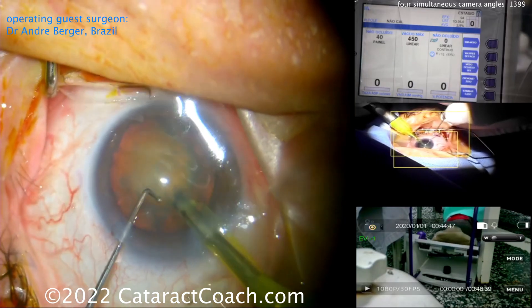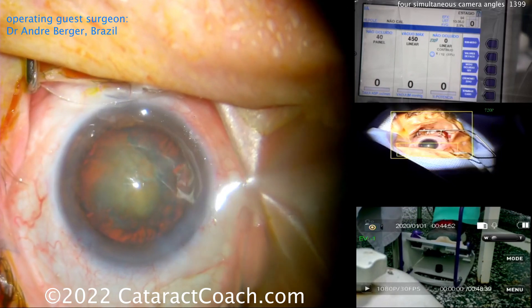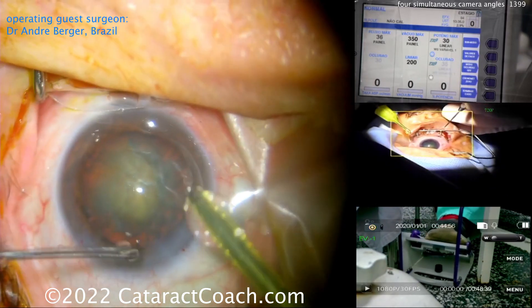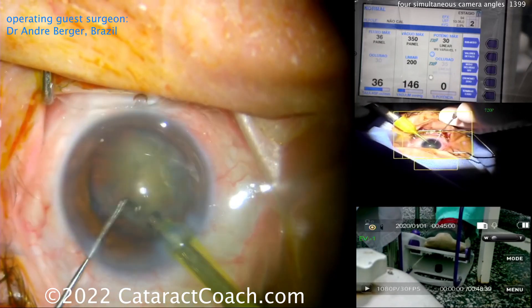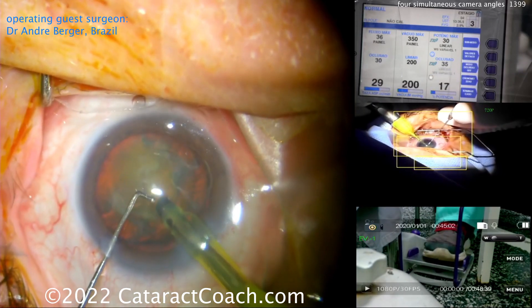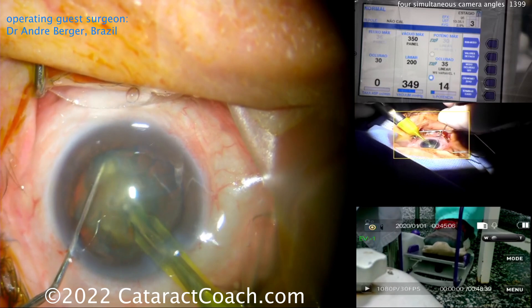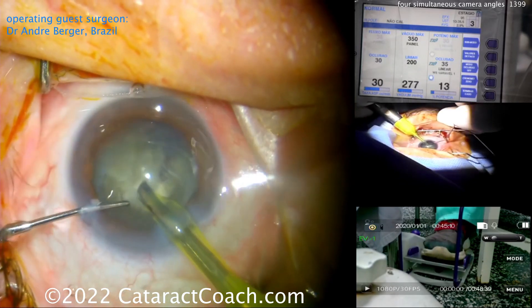He was going to buzz into the nucleus but something's not quite right — the settings aren't right or the tip's not set up appropriately. He'll come out of the eye and get that set up or change his phaco parameters. Now he's good to go — buzzing in with the phaco probe, getting a good purchase on the nucleus, chopper going around for a nice clean horizontal chop. There it is.